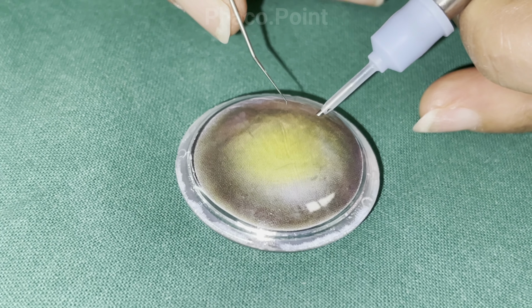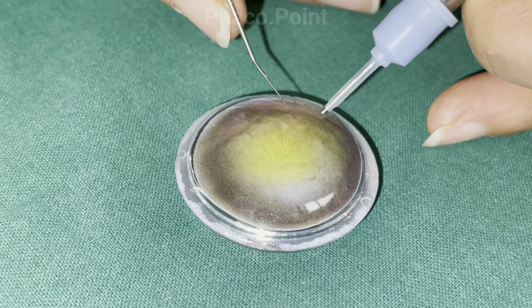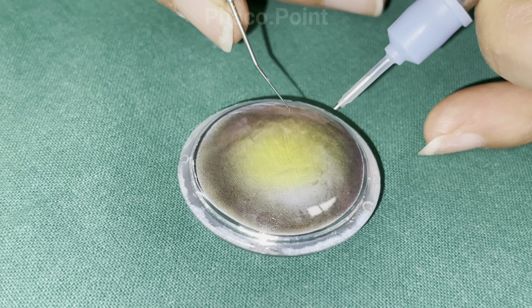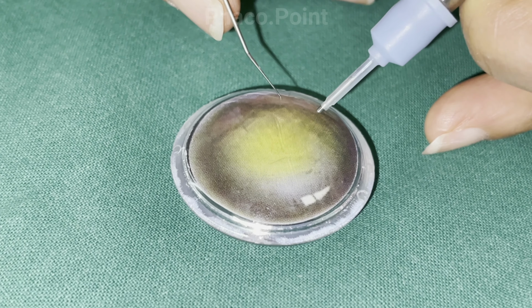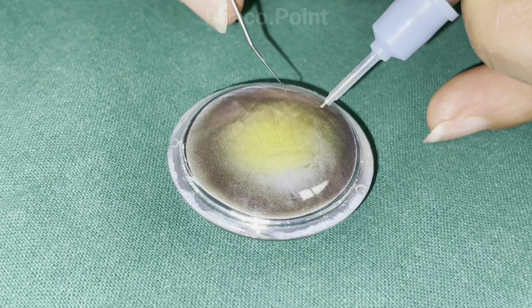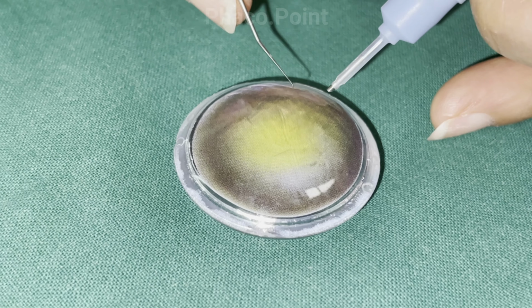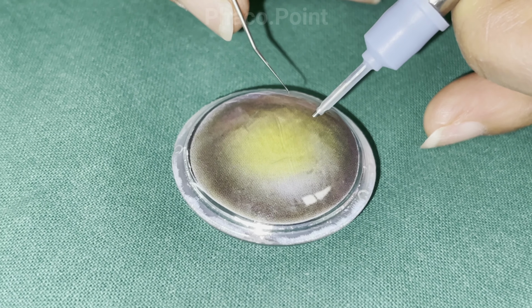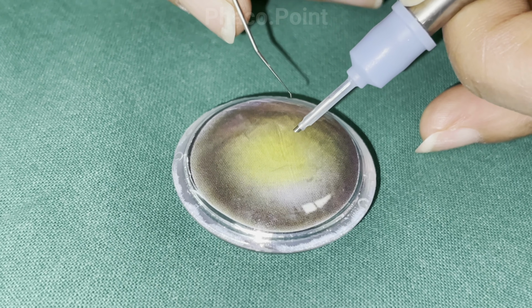So as your foot pedal moves into foot pedal 3, that's when you start chopping the nucleus. Your probe now starts burying, as though to go towards the center of the nucleus, starting point being just beyond the proximal rhexis. So foot pedal 3, the phaco starts, and then you go all the way down. It is blind. You bury it till you get a good hold of the nucleus.